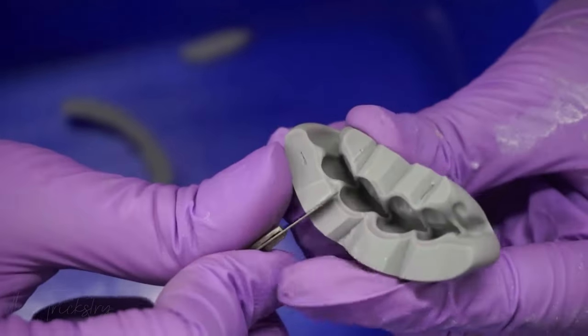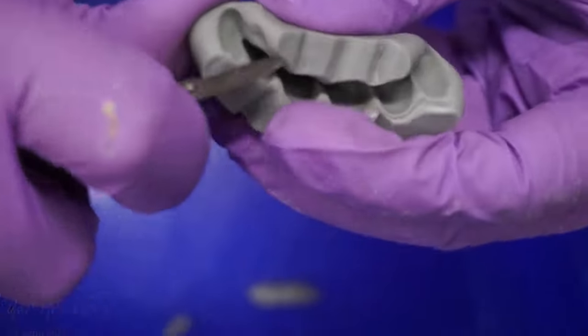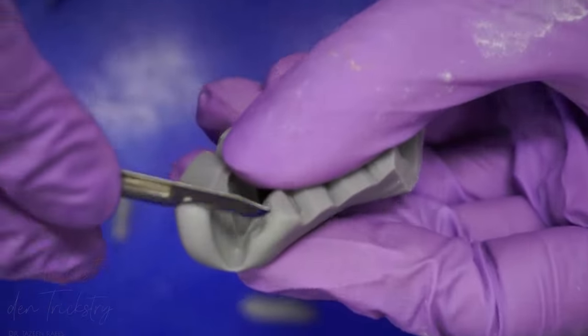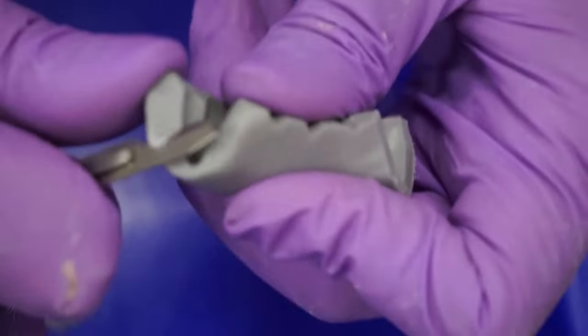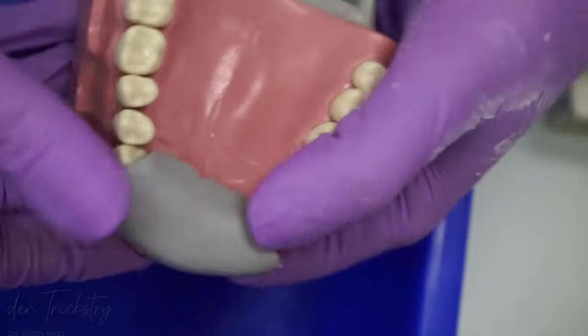One more thing that I like doing is cutting off the blunt ends of the index. This helps us confirm that the index is closely adapted to the teeth. If there is any space in between, you will have to repeat it.